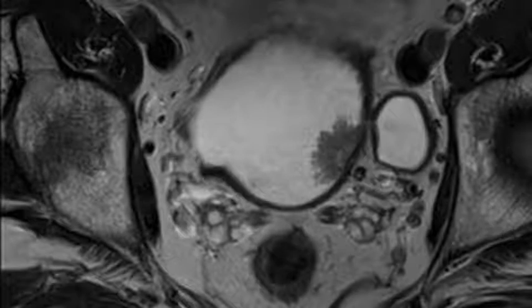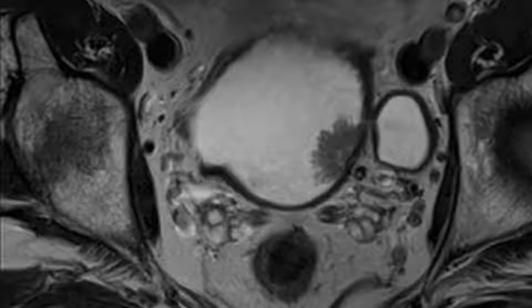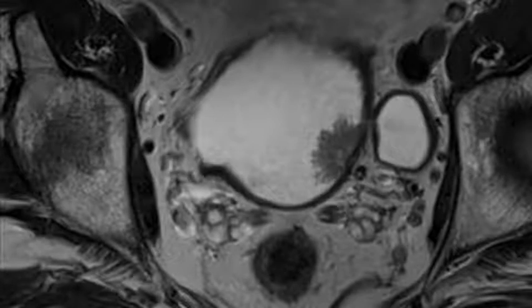Despite these encouraging results, CT urography cannot be used as a replacement for diagnostic cystoscopy in most patients with suspected bladder cancer. CT does not typically allow the confident diagnosis of flat lesions and lesions at the bladder base adjacent to the prostate gland, particularly in patients with benign prostatic hypertrophy. A major difficulty is differentiating tumor recurrence from inflammatory wall thickening that occurs following endovesical chemotherapy and from scar tissue after TURBT. The general technique for CT urography has been previously published.